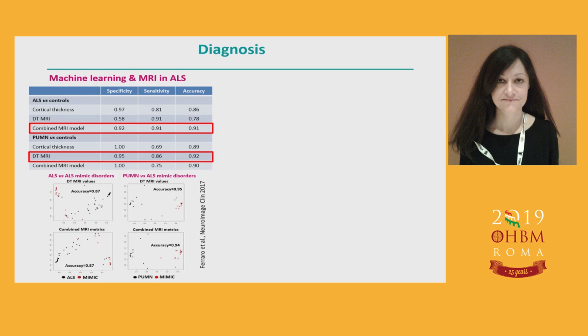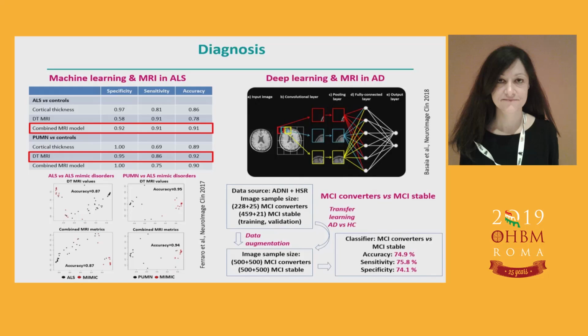And then another example, in Alzheimer's disease patients, we combine the information you can obtain using a 3D T1-weighted image with a deep learning approach.